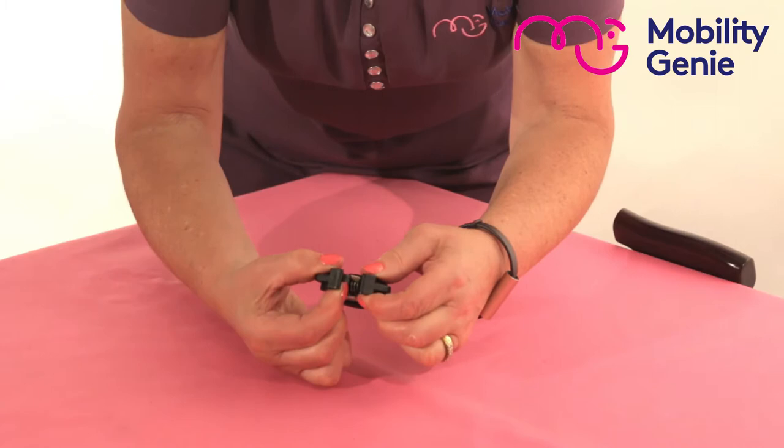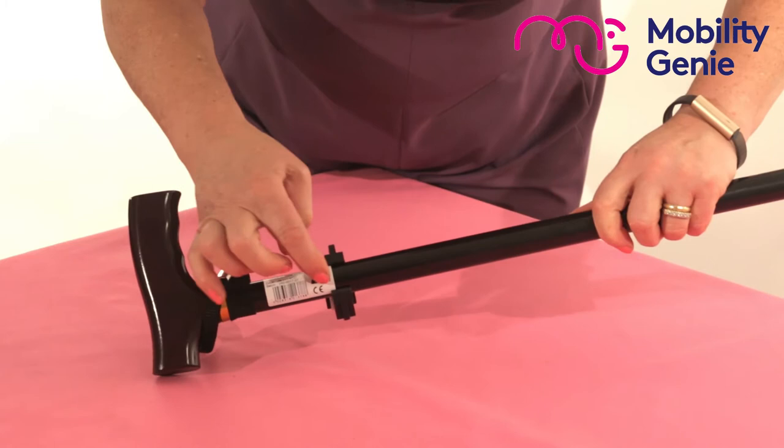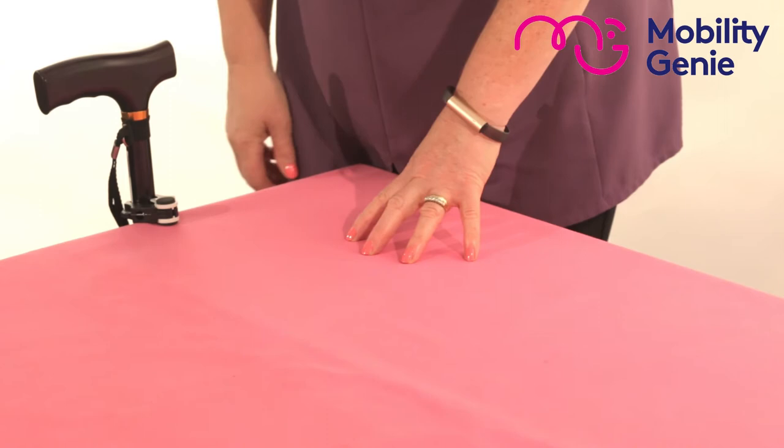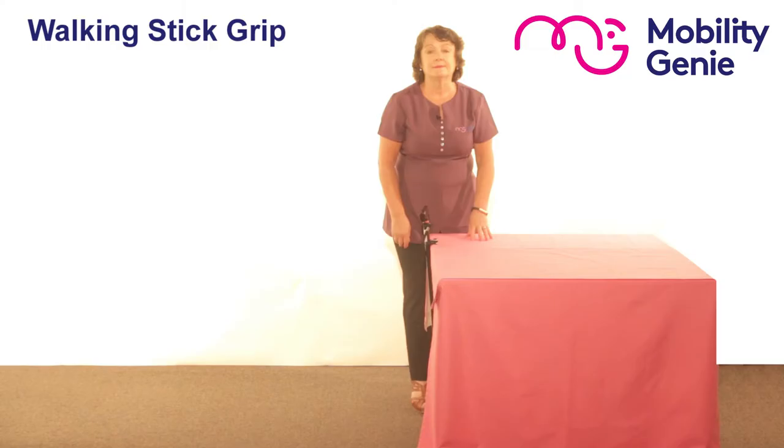Here we have one side of it that, when you open it and clasp it around the walking stick just like so, you'll see that it's clasped around it. The other side of it then allows you to rest the stick on the corner of your worktop, and it keeps it still.